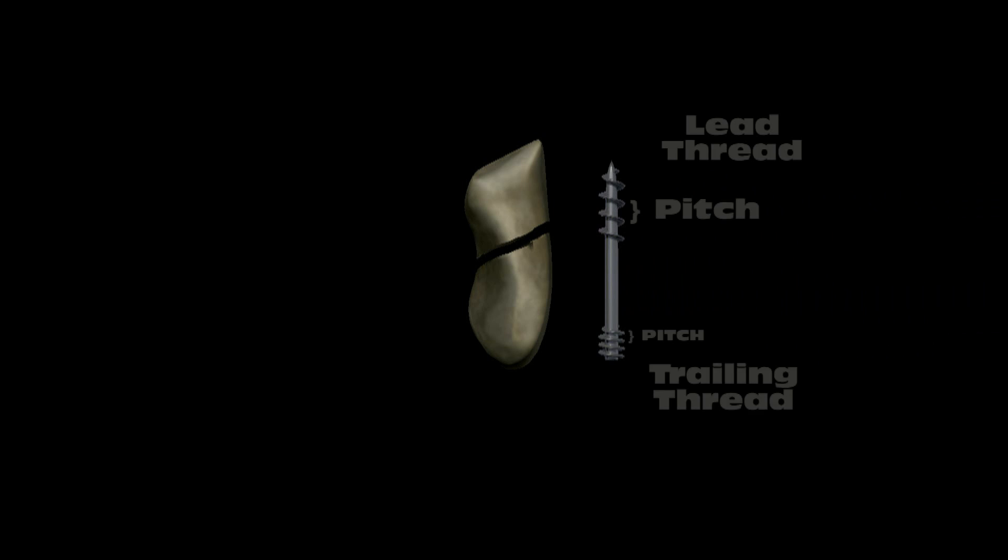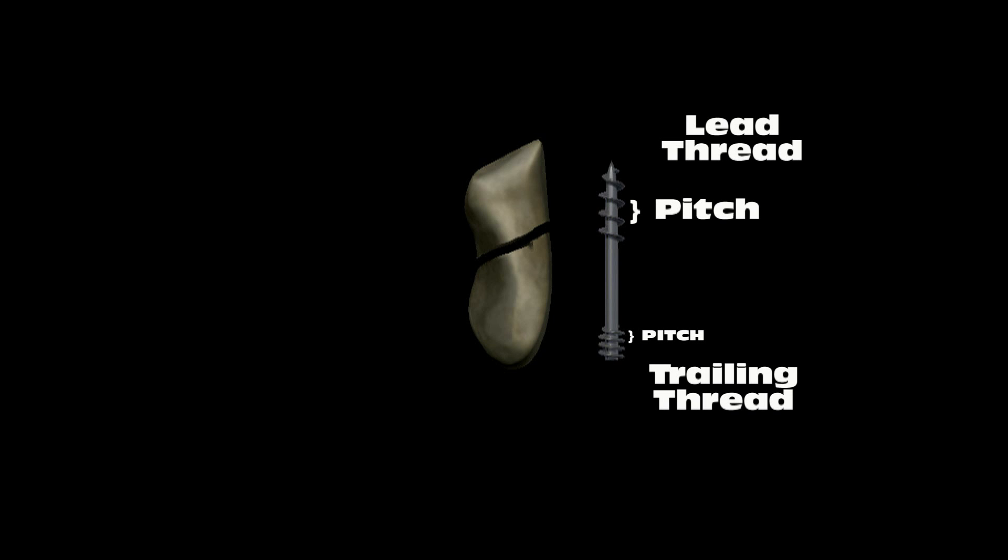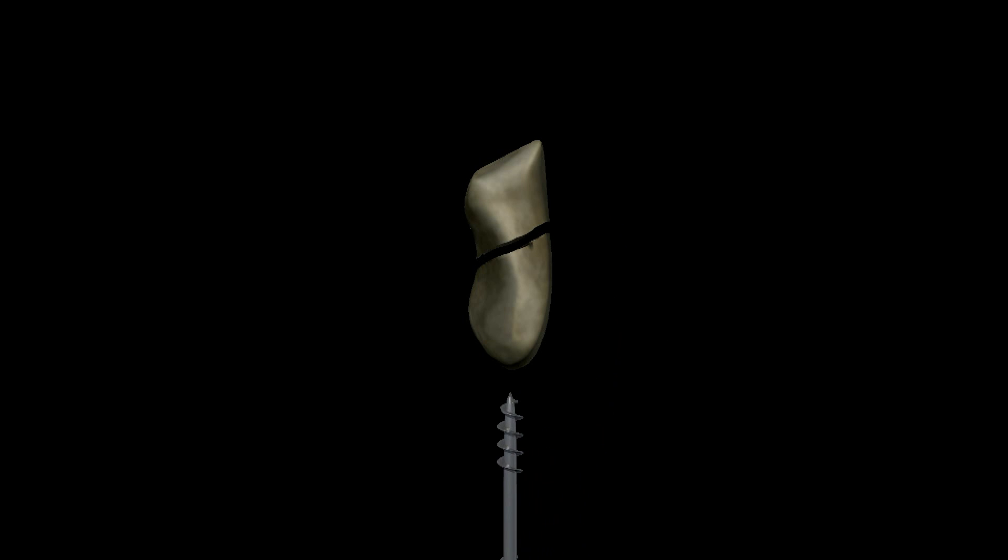Notice that the lead thread has a wider pitch than the trailing thread. This wider pitch means that the front of the screw covers more space in the same number of revolutions. So the fragment that the tip of the screw enters is pulled toward the rest of the screw, compressing the fragments together.